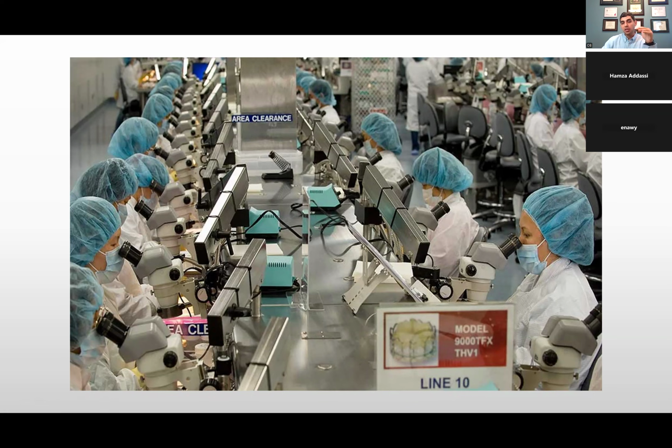So let's say someone in Jordan gets a TAVR valve. The person in Jordan can know exactly who sutured his valve, even though they're in completely different parts of the world, because they keep an accurate database of who sutured what valve and which patient got that valve. So that's one thing. Then the other question becomes, how do you get that valve in the body?